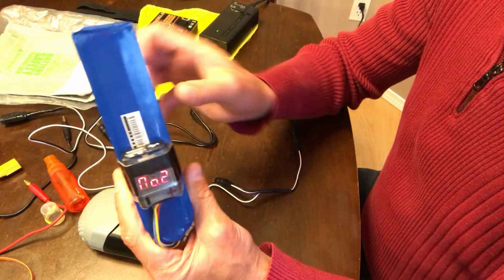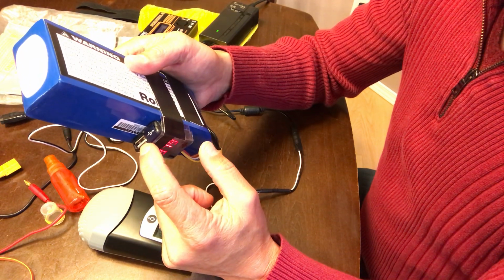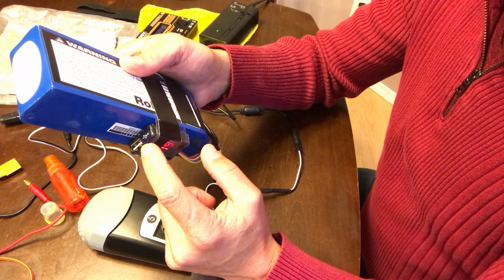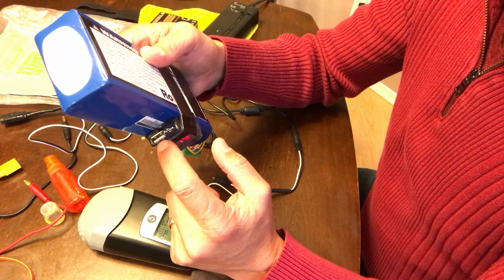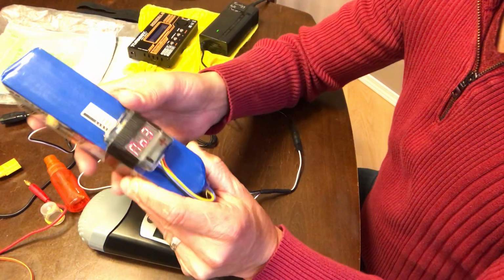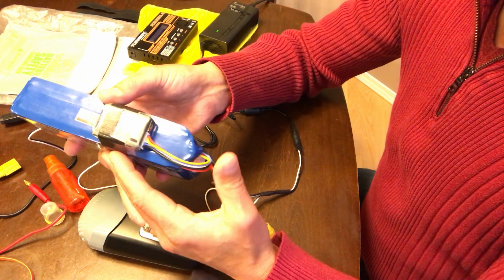And the beauty of this is it also has a USB port here. So when I'm backpacking out in the backcountry, I can be charging my iPhone while hiking out in the woods. So that USB port, although it's only a 1 amp or 1.1 amp output, it's still a way to charge your battery. Fantastic. So I tape that right to the side of this battery. I check it when I need to, and I use that USB port.